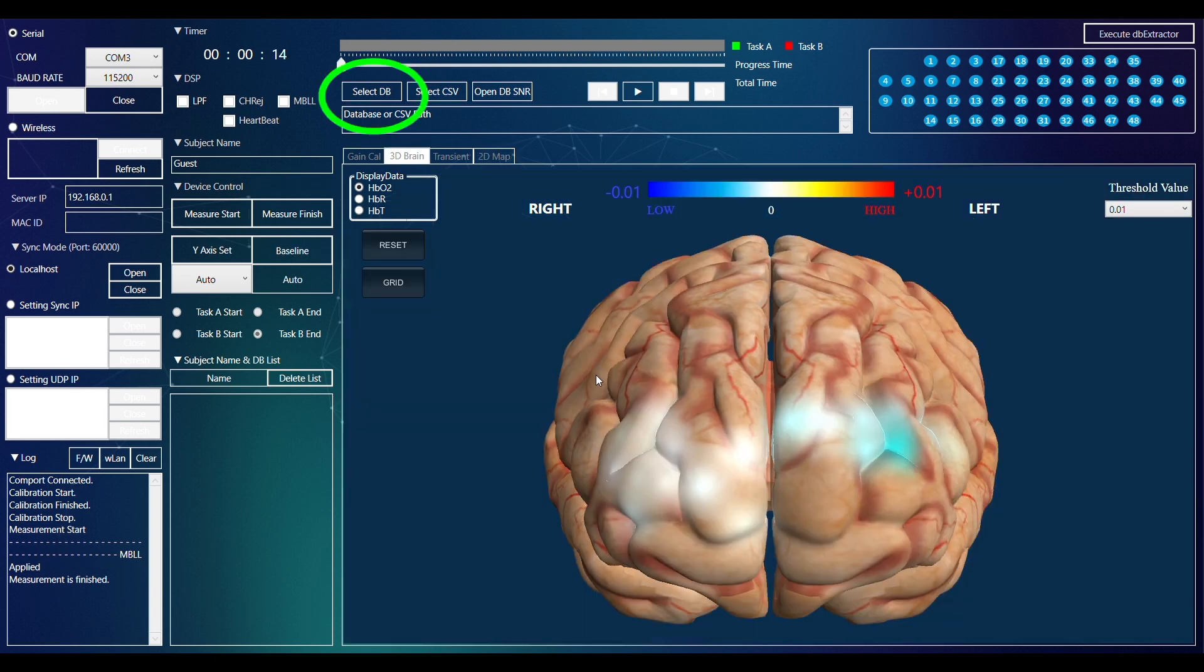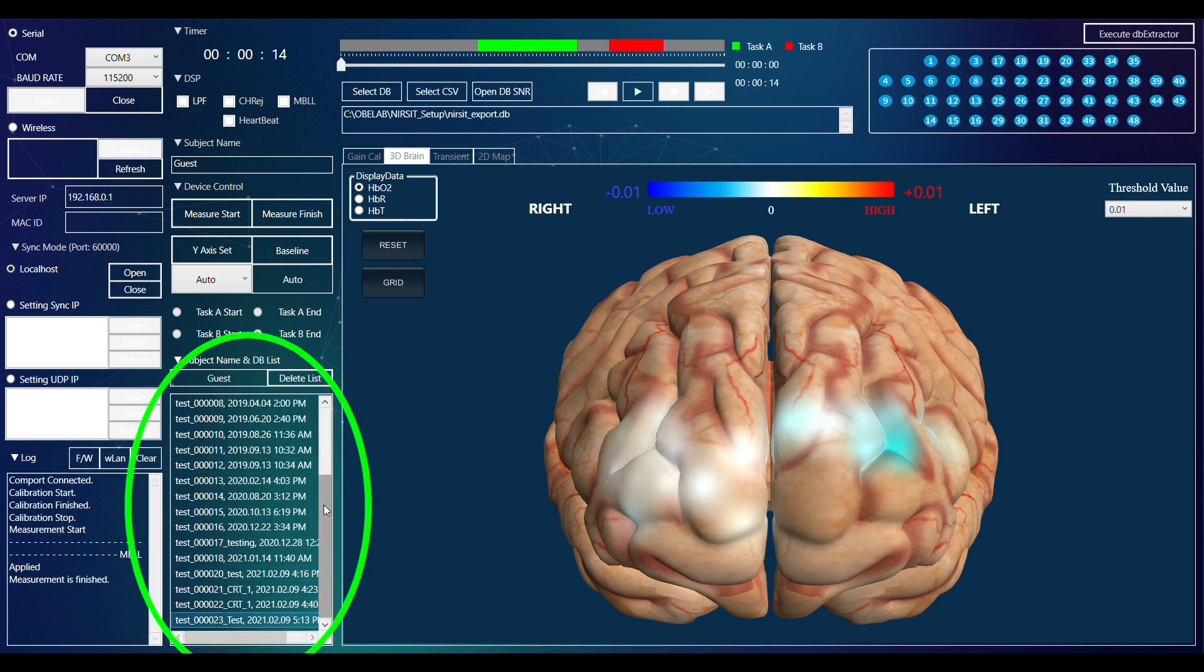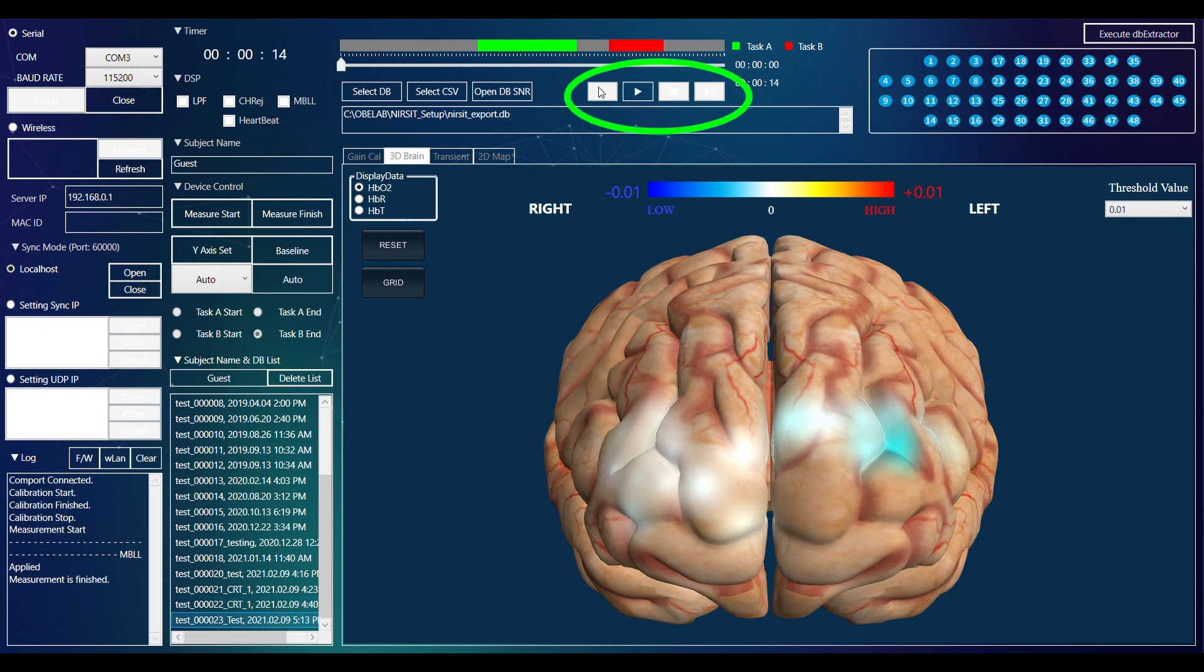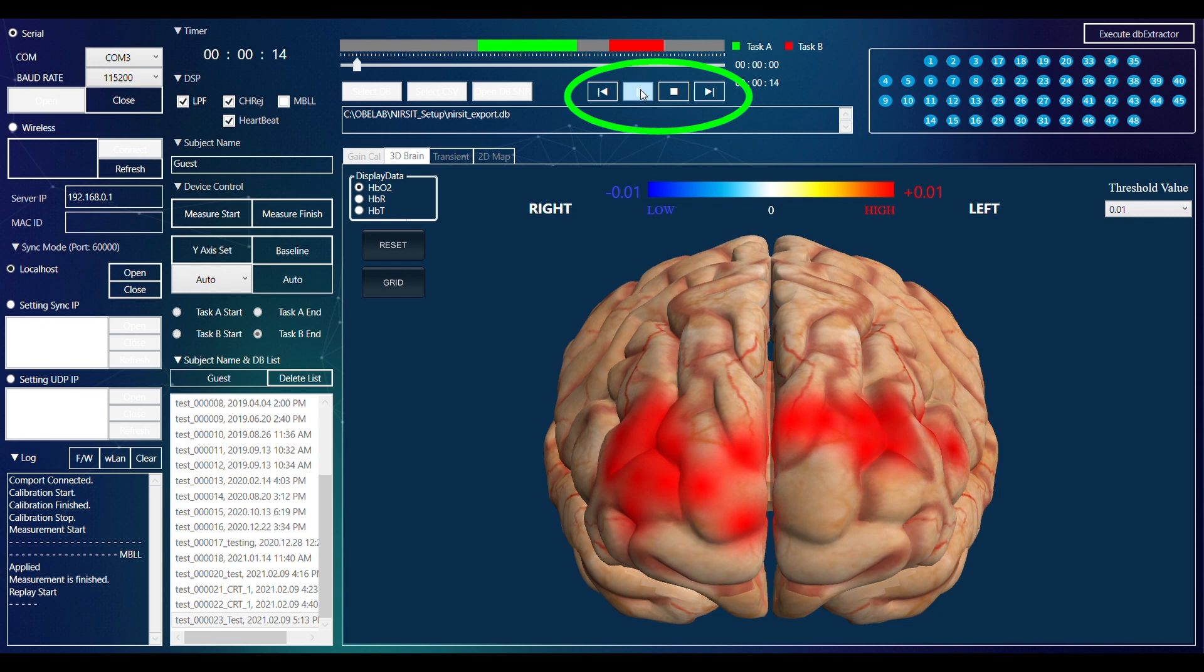To start the replay process, use the Select DB button and select the file you want to replay. Use the Play, Stop, Forward, and Backward buttons as needed.